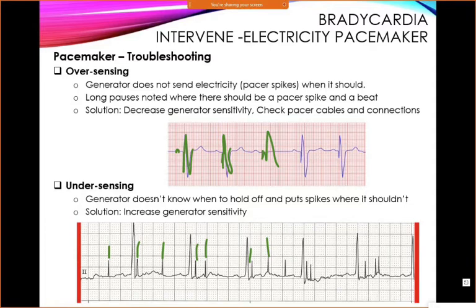It shouldn't be throwing spikes after a beat. It's putting electricity during the reset period. It's stimulating the heart during heart reset. After a QRS, there should be no electricity stimulating the heart. After the QRS, the heart needs time to reset. If you're throwing electricity after the QRS, you could fire something during reset time, which will send the heart into fibrillation. So we need to protect this.